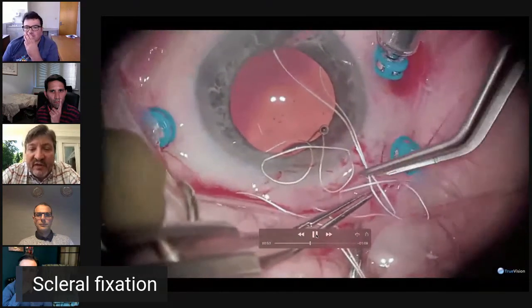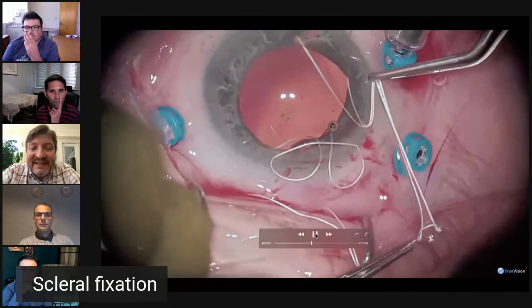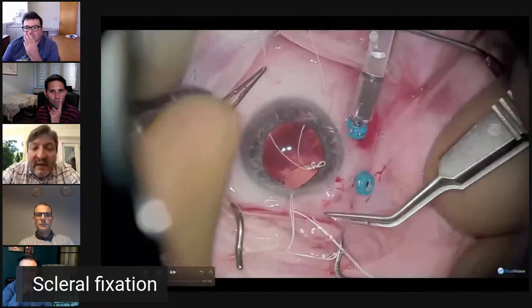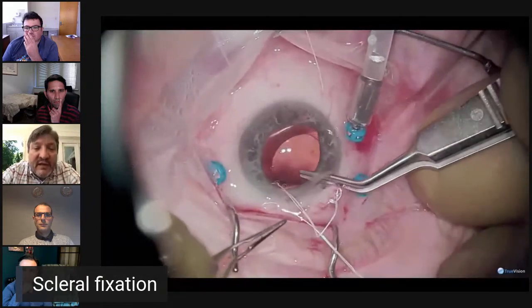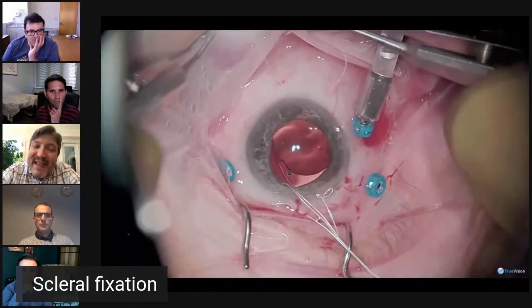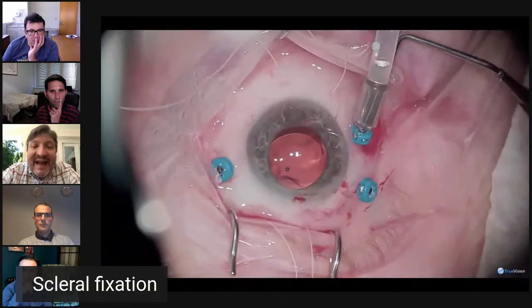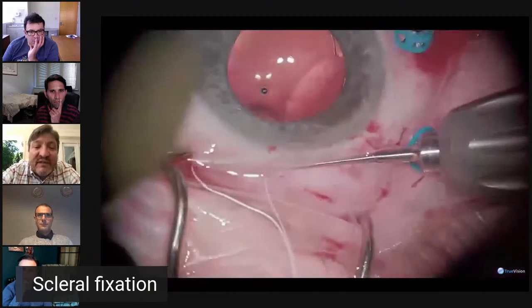We make the girth hitch. We take this big CZ70 lens that has a 7 millimeter optic, and put a girth hitch around each haptic. You're seeing I'm not going through the eyelet. I'm going around either side of the eyelet, and that gives me beautiful 4-point fixation.